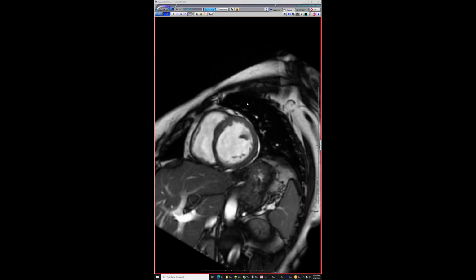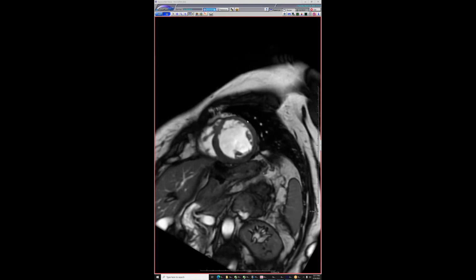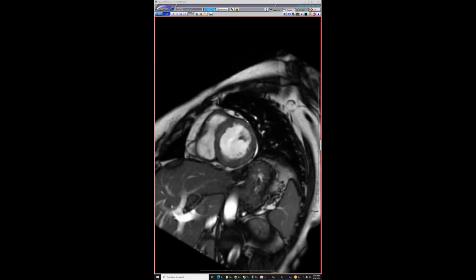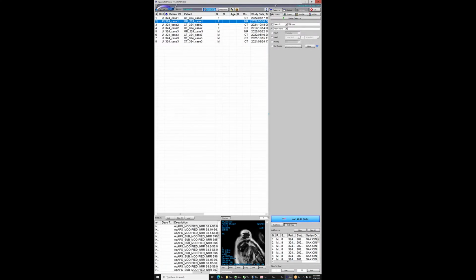So this is a young patient. I think she's 42, came in to the ED from the outside hospital. I think everyone can see that basically the entire left main territory is not moving. Maybe the whole anterior septal, anterior lateral going into the inferior lateral has a little bit of movement. What's impressive about this is the severity of it is just striking, at least for me.